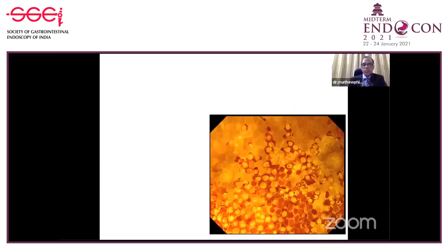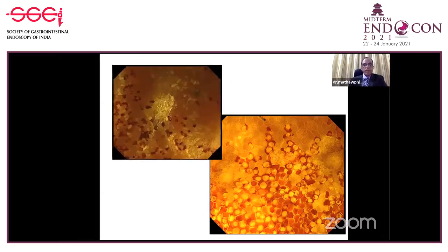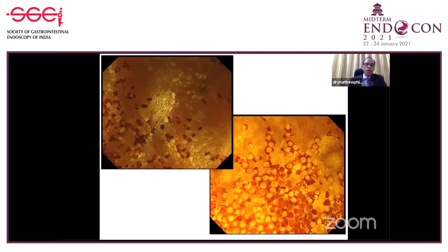So when you do a zoom endoscopy, like endocytoscopy, you can see the cells, and here there is no nucleus because this is a dead leaf, and you can see a very clear-cut picture of the cell wall and structure. Yes, now it is very clearly seen that the cellular structures are variable. This is actually the optical histology or optical biopsy. So from white light, we have gone up to a cytological analysis by endoscopy.